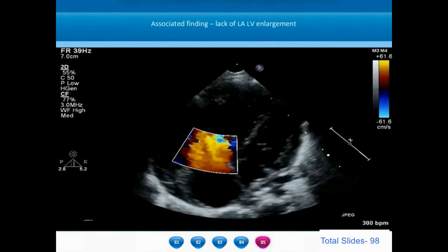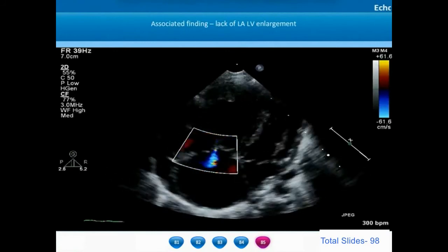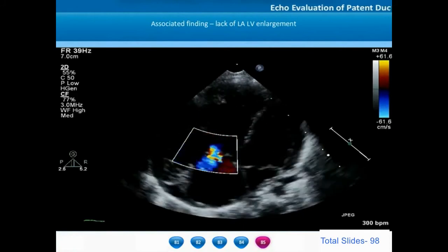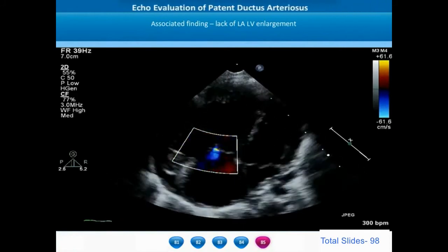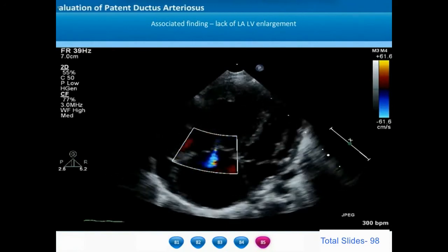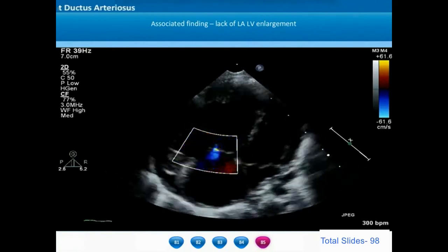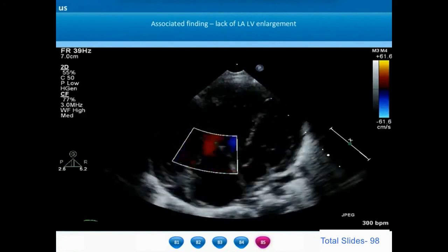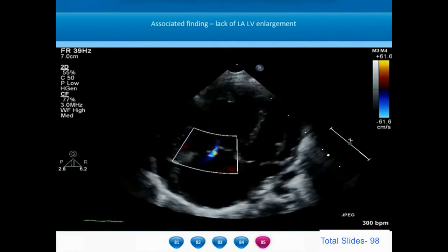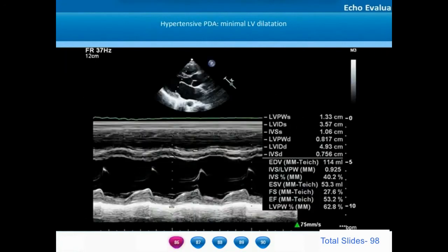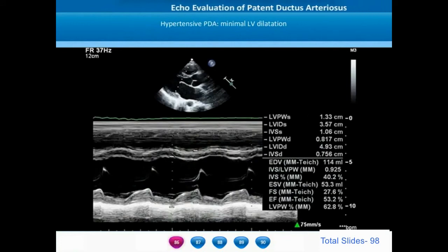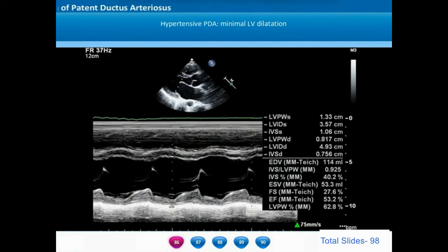On the apical four-chamber view of hypertensive PDA patients, there is no left atrial or left ventricular dilatation at all. On the contrary, the right atrium and right ventricle are distended, right ventricular systolic contractility is impaired, and there is tricuspid regurgitation due to reduced right ventricular systolic function and tricuspid annular dilatation. On M-mode, the left ventricle is not dilated and left ventricular dimensions are nearly normal.